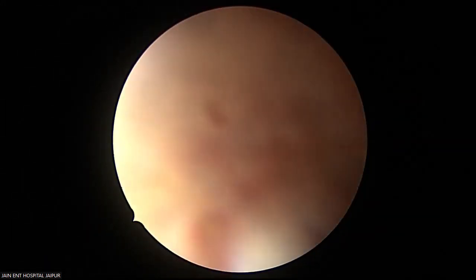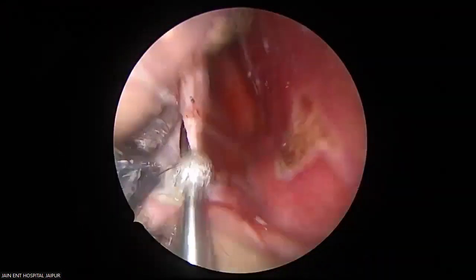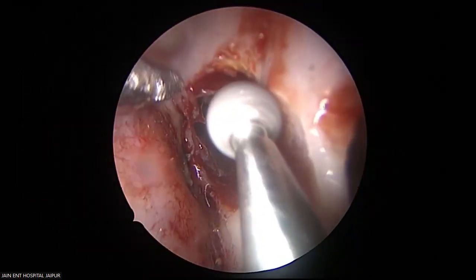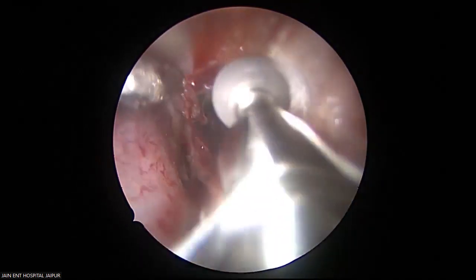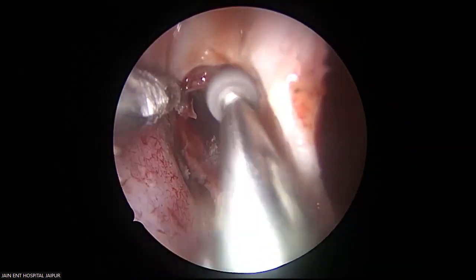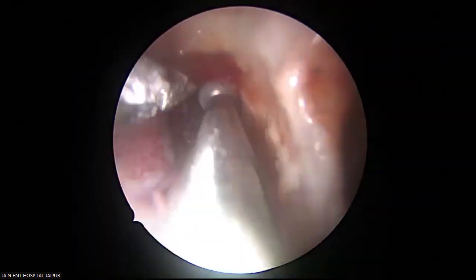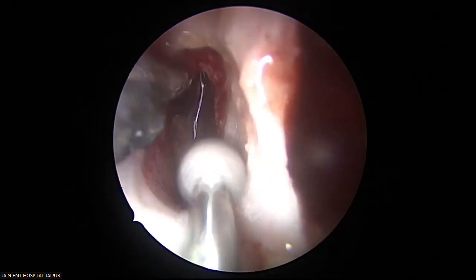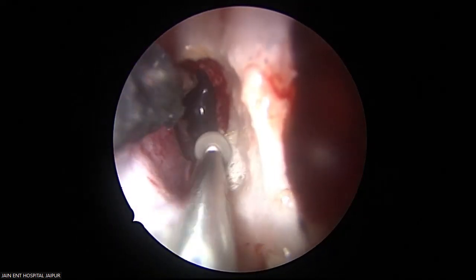See, my superior limit is going to be the floor of the orbit. We don't want unnecessary accidental entry into the orbit at this place. I will further widen it more and more all around.